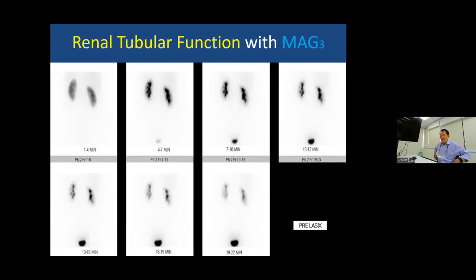And then the ureteropelvic junction is like a hump. So with a patient lying down, the activity coming down into the pelvis has a hard time going over that hump. So you have to erect the patient, sit the patient down, and the camera should be in the posterior back. That's the most important physiologic position.